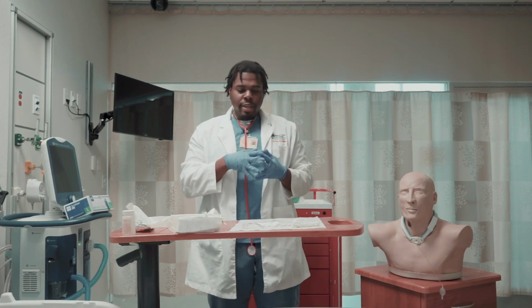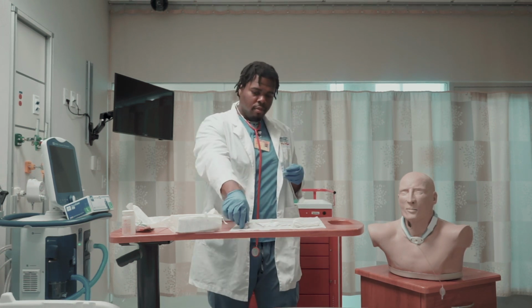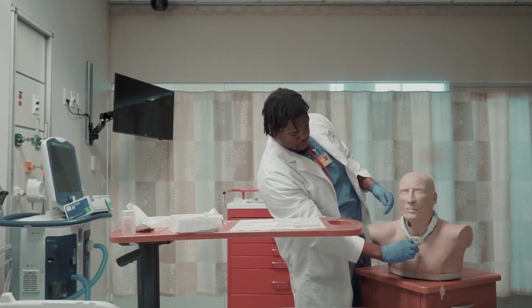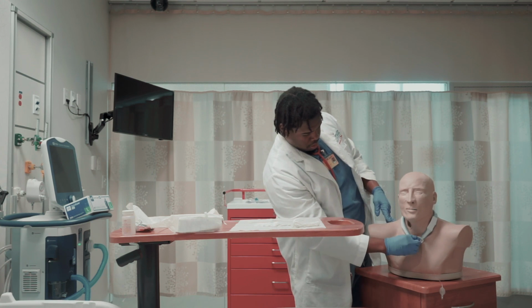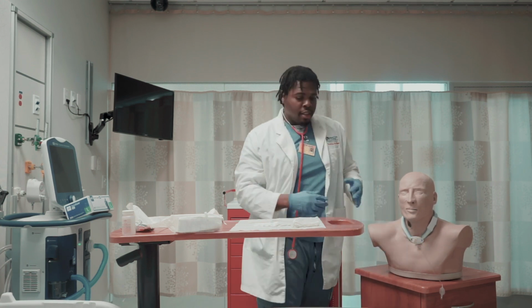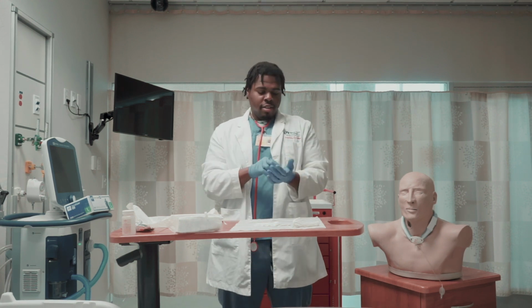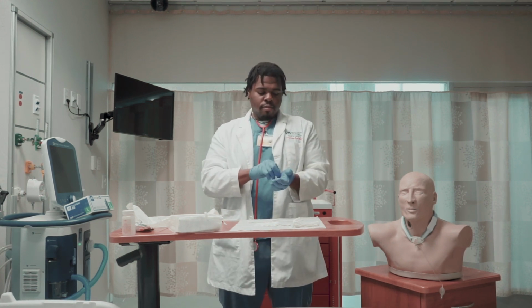Now I'm going to put his inner cannula back in. Now that I've put his inner cannula back in, I'm going to take off my sterile gloves.